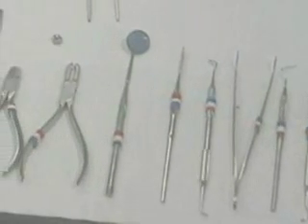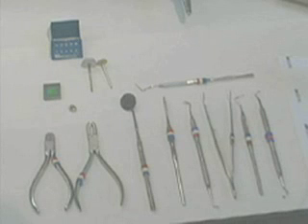Today's exercise is the stainless steel crown restoration. Indications have been discussed in class, so you just need to follow the guides. Stainless steel crowns are used in the full coverage restoration of both primary and young permanent teeth.